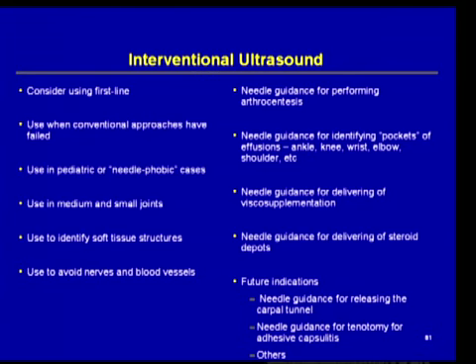For example, if a patient has a swollen knee, is that fluid indeed in the joint of the knee, or is it in one of the many bursa surrounding the knee? So needle guidance is also key for delivering viscosupplementation, and the number of viscosupplements that are used for patients with osteoarthritis of the knees. We also can use needle guidance with the ultrasound for delivering depositions of steroids, whether into the biceps tendon or into the acromioclavicular joint of the shoulder.